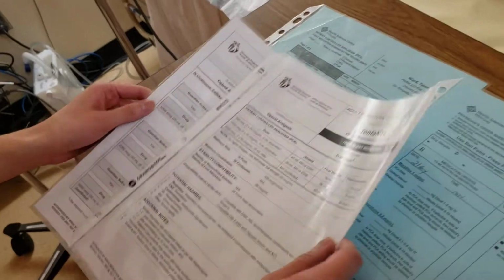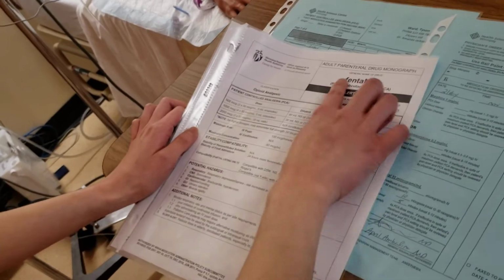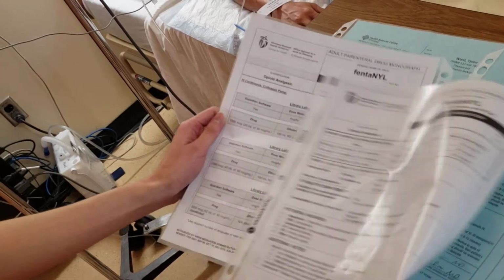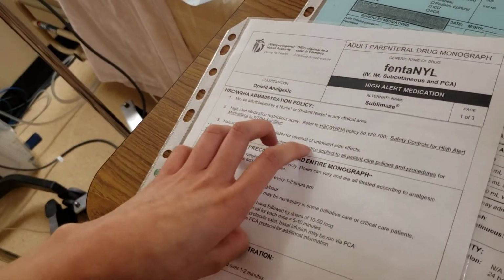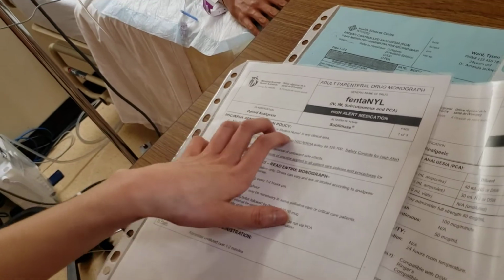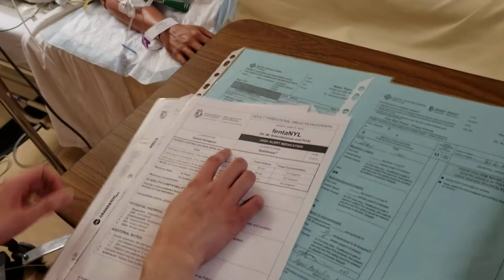For the PDM, we make sure that we're looking at the PCA monograph for the fentanyl. Fentanyl can be given by PCA. It's a high-alert medication, so we make sure that we have naloxone available in case the patient has a reaction, and it can be given by a student nurse. And we are looking at the PCA.